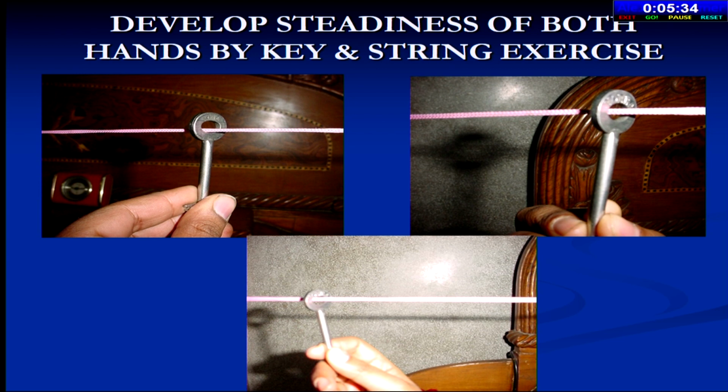So learn to put this key like this without touching, with the left hand also. Be bidextrous, learn the steadiness of the fingers and this joint, and use the wrist. The wrist is what is required in Phaco, not the elbow, not the shoulder at all. So learn that, whatever way you can, left hand during SICS, left hand wherever you can.